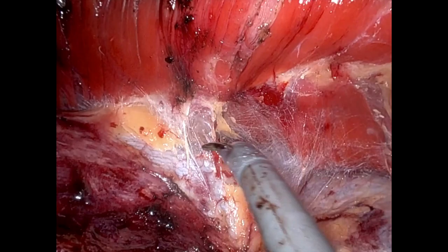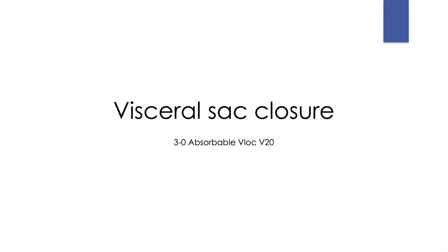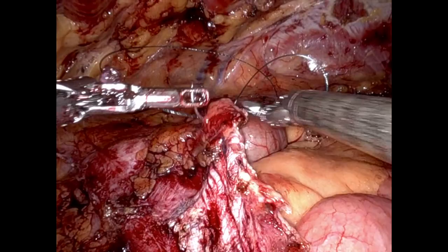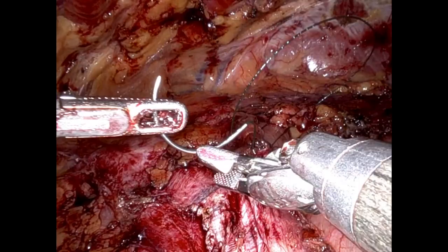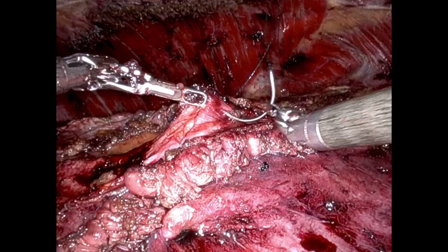With dissection extending to the retroperitoneum and the lateral abdominal wall complete, we'll start with visceral sac closure. I use a 3-0 absorbable V-lock. I will run this from the bottom and the top, and depending on the size of the defect, we choose the appropriate length of suture. In this case we used two 12-inch sutures. Working from the head down, the posterior sheath is being re-approximated.